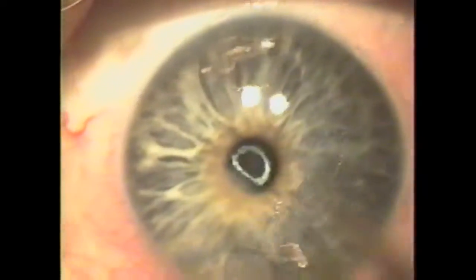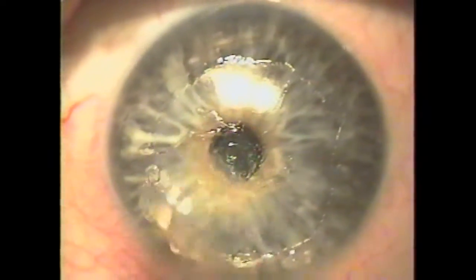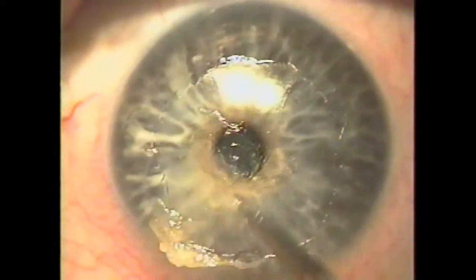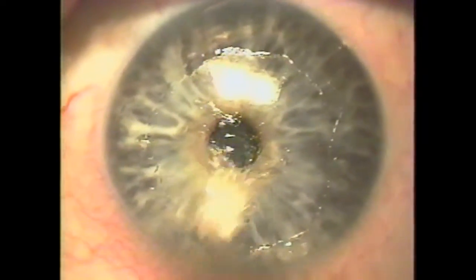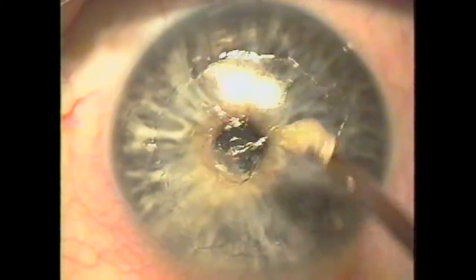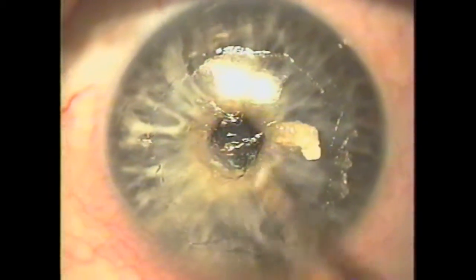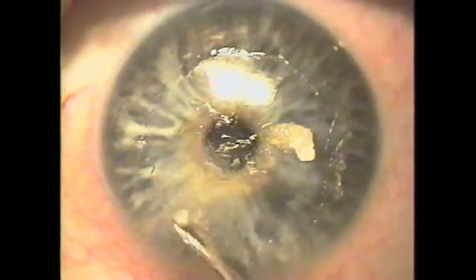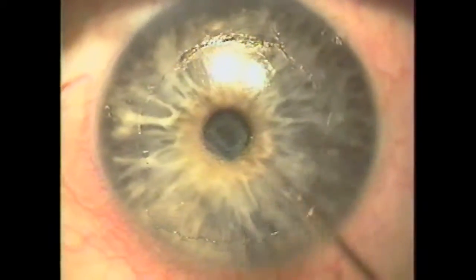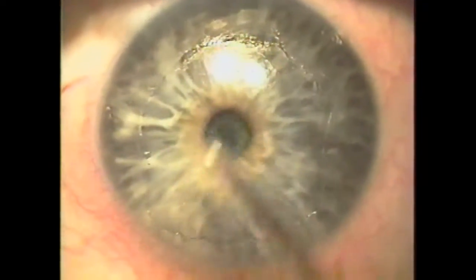With fast movements, take off the epithelium except in the area of the scar, leaving that for last. Following my corneoplastic principles, herpetic scars usually become part of the cornea, so you'll see a smooth surface at this point.